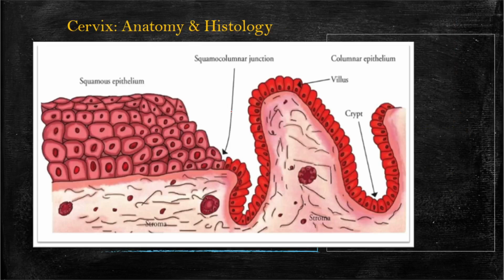So this is what that squamocolumnar junction looks like. Again, we've got squamous epithelium here, and these layers, and losing the nucleus there, compression, and really just clear cytoplasm as they're stacking here. And then, of course, here it shows a very abrupt transition where this junction is at into the kind of single layer of columnar epithelium, the single layer of cells that also do have a bit of a kind of rugated appearance. These are the crypts of the glandular or columnar epithelium.